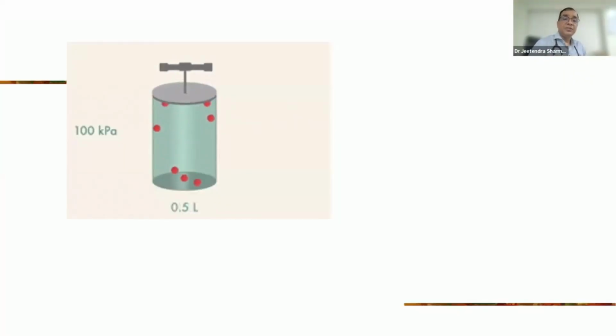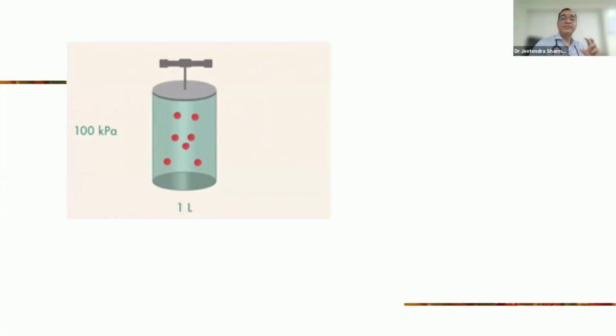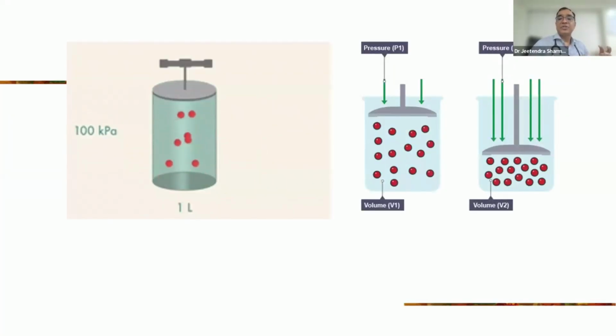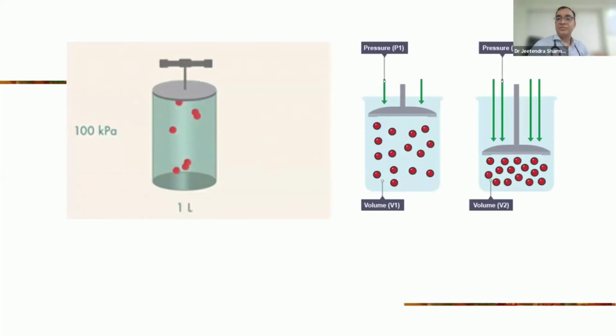So now coming to our gases. Basically, when we deal with the gas, we have two options. Either we can measure the gas in volume or in pressure. These are the two major things over there. If we want to keep the pressure constant, then the volume is variable. And if we want to keep the volume constant, then the pressure will be variable.